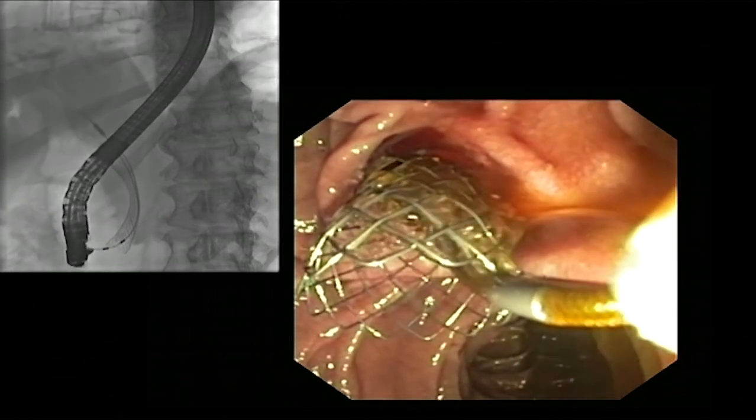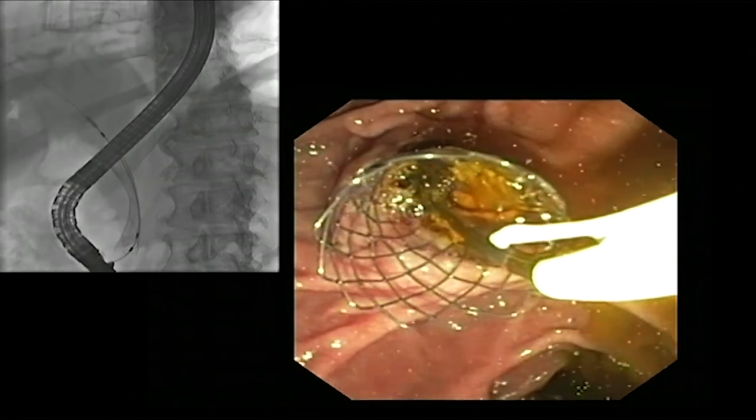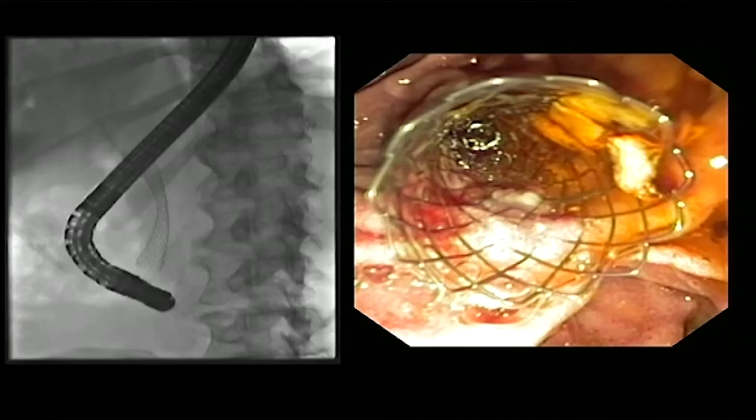And there we have full deployment of the stent, very nicely positioned outside the ampulla for about 1.5 centimeters. And there we see the stent nicely positioned. We see some of the indentation of the stent almost in the middle, so it's a very nice symmetrical position. And that concludes the deployment of the Evolution uncovered 6 centimeter metal stent.